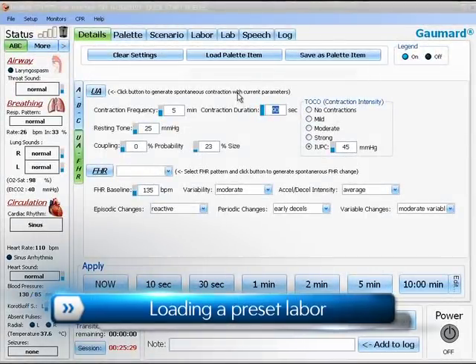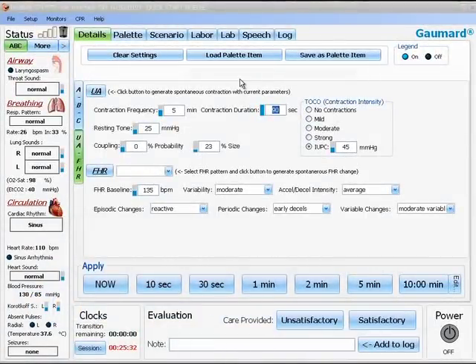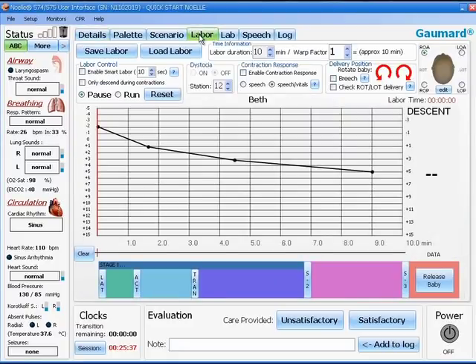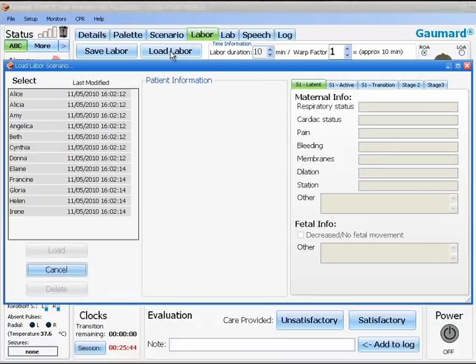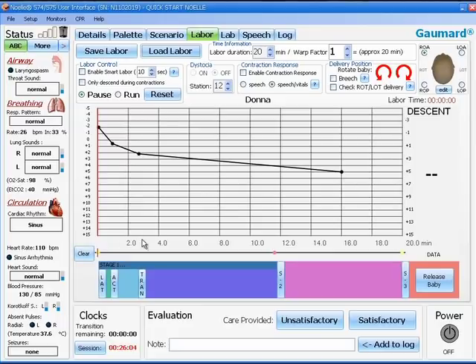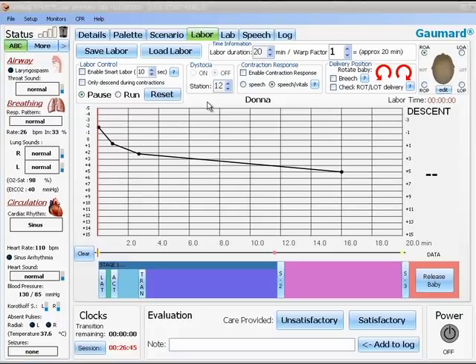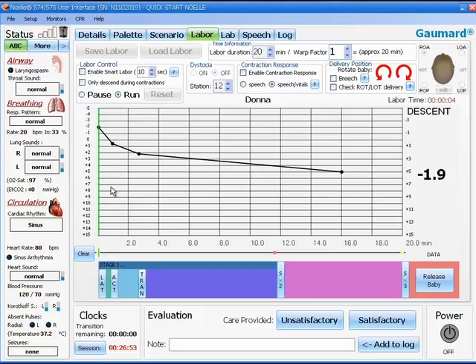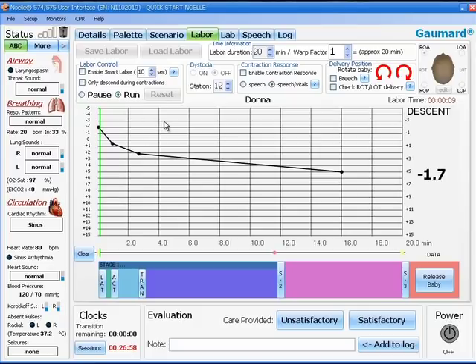Now we want to load a preset labor. We do this by clicking on the labor tab. And next, click on the large blue icon that says load labor in the upper left. A window displaying mother's names will appear on the left-hand side. Choose one of the mother's names, click on it, then click load. The labor will now load onto the labor tab screen. After the labor has loaded onto the labor tab window, you may start the scenario by pressing run. You will notice that the red bar on the left-hand side of the screen turns green and begins to move to the right.